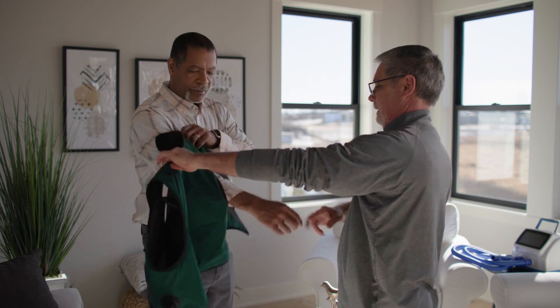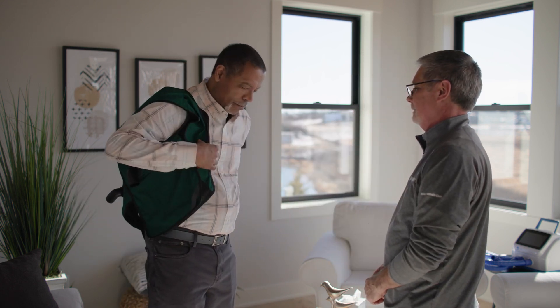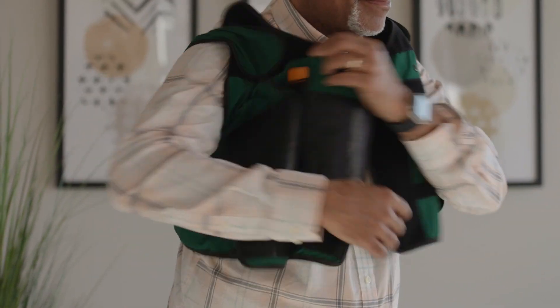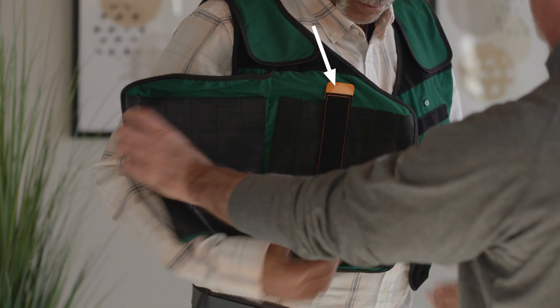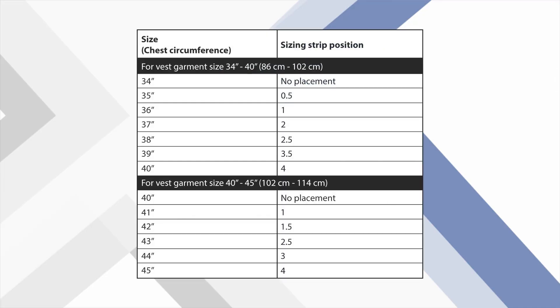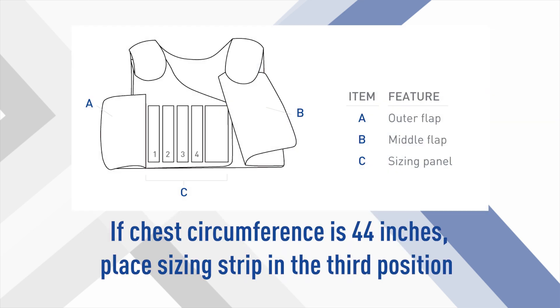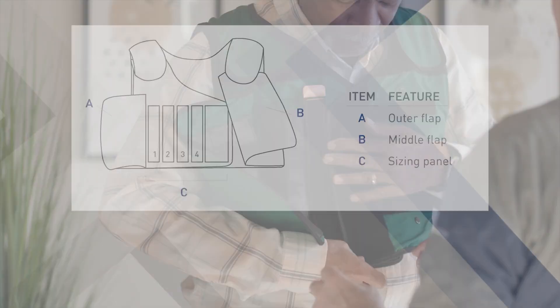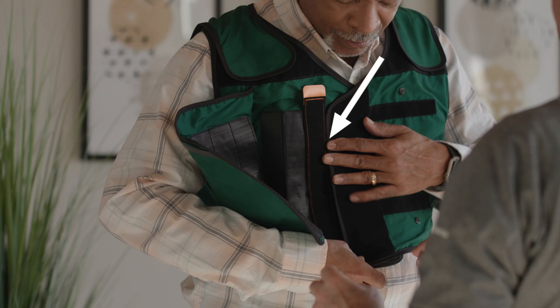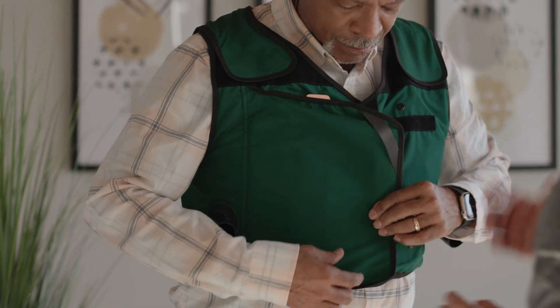To begin the fitting process, put the vest on so that the air hose ports are in front and open the outer flap. Using the sizing strip can be helpful to find the ideal fit for your garment repeatedly. Find the correct sizing placement from the sizing strip placement table in the IFU appendix and place the strip in the corresponding location on your vest garment. For example, if your chest circumference is 44 inches, place the sizing strip in the third position. The edge of the middle flap should be aligned with the edge of the sizing strip. Do not overlap the middle flap with the sizing strip. Place the outer flap over the top of the middle flap. Your vest garment is now fitted to you.